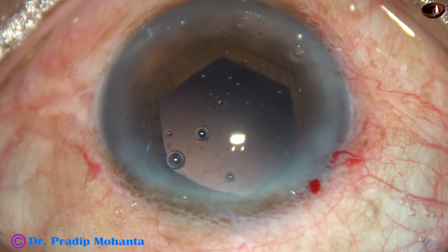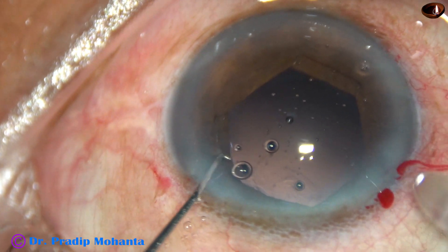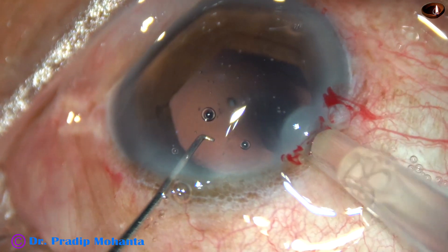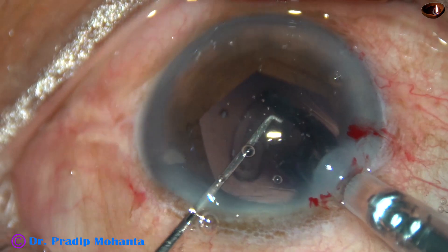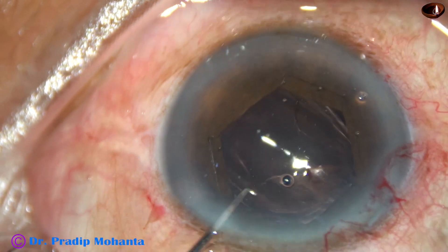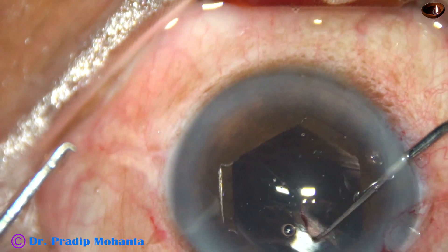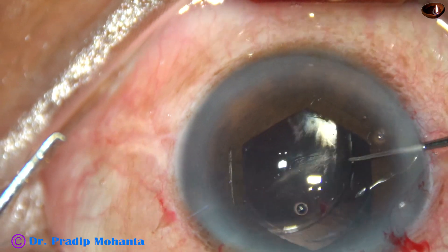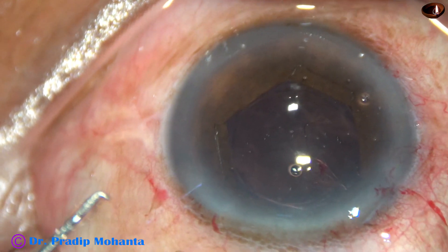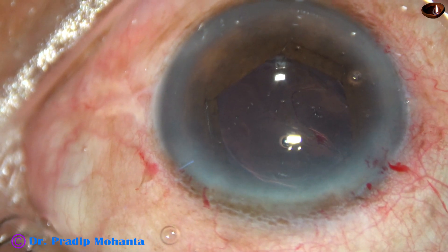A foldable monofocal intraocular lens is being implanted in the capsular bag. This is a hydrophilic lens. The patient belongs to lower socioeconomic status and cannot afford a hydrophobic lens.